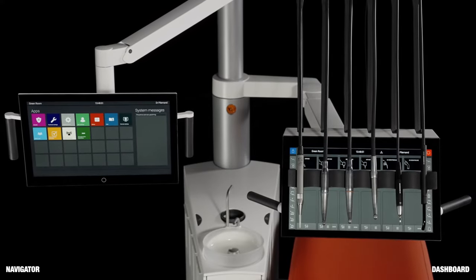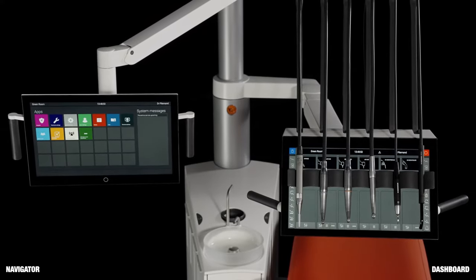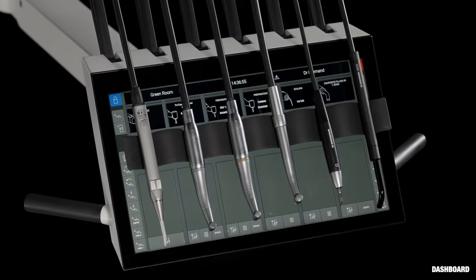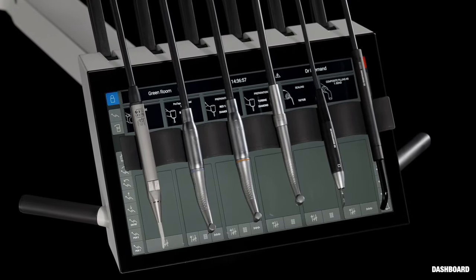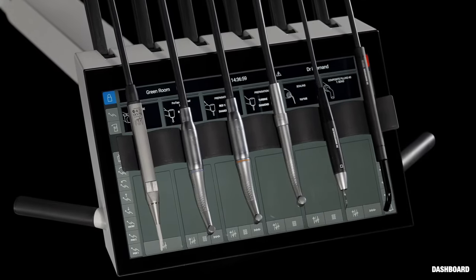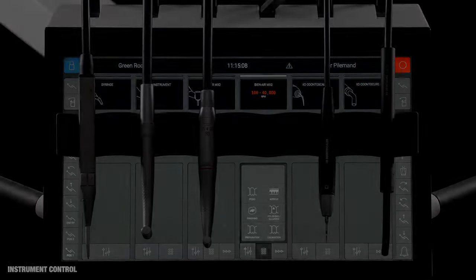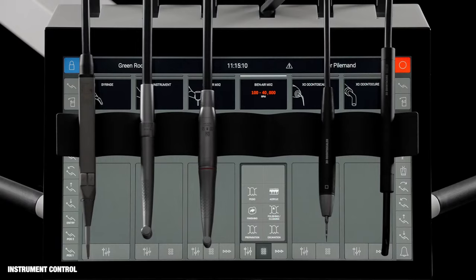ExoFlow is a digital dental treatment solution based on new technology not seen before in dentistry. One such example is the dashboard, a touch-activated graphical user interface integrated into the instrument bridge. Buttons on each side of the dashboard make it easy and intuitive to control all functions. Each instrument has a control window for setting up the instrument and a display for monitoring data.